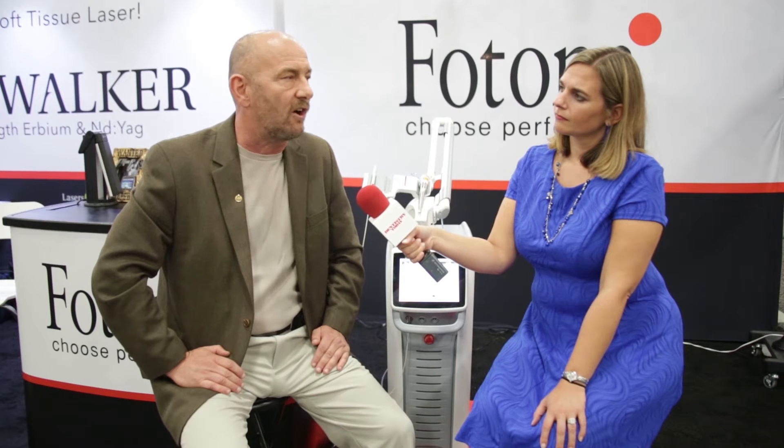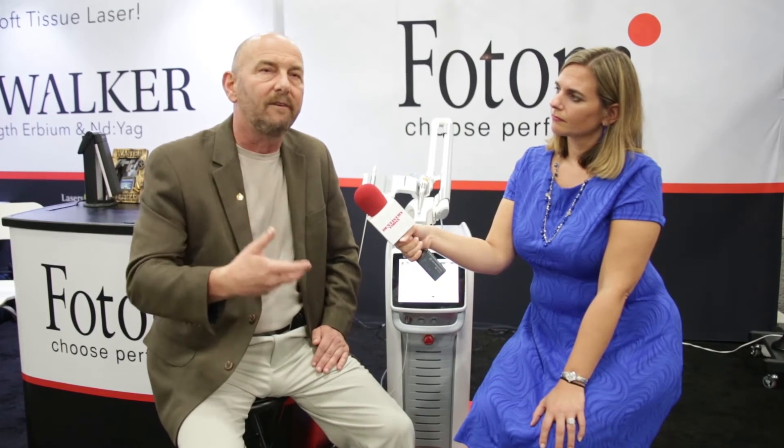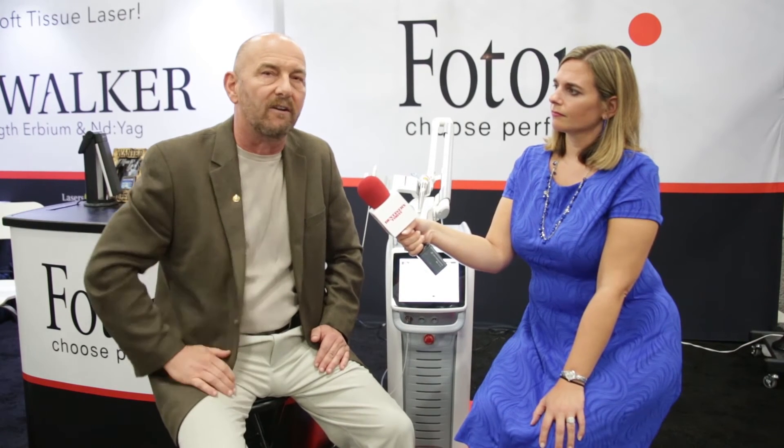I can effectively cut teeth very rapidly, prepare teeth, and get rid of carious lesions. I use it all the time in endodontics — there's a technology called PIPs, photon-induced photoacoustic streaming, which allows us to literally remove all of the bacteria from inside the tooth and clean it three-dimensionally, so when we obturate and fill the root canal, we know everything is gone. It's virtually sterile inside the tooth once we've used that PIPs technology.